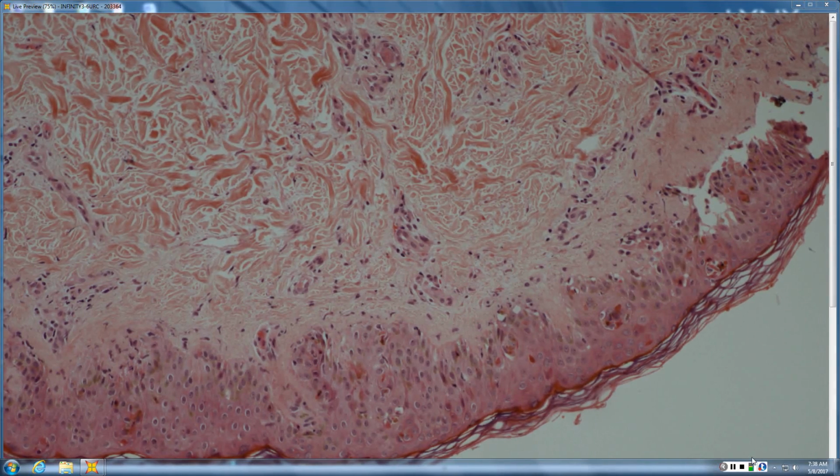The other thing is GVH, very acute, could have a corneum like this, but most GVH we see as subacute, and so there's some alteration in the corneum. So more atypical and more alteration. More atypical, but you're absolutely right. That's another thing that should have been discussed in the differential. My omission. Yeah.